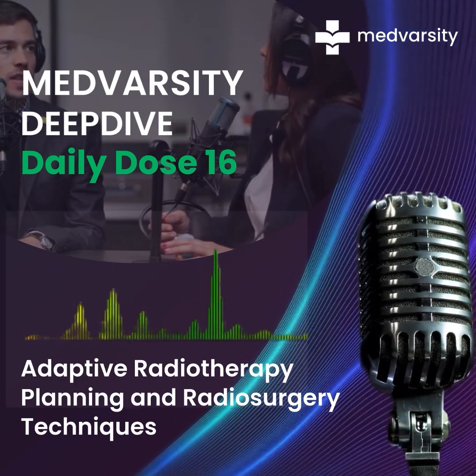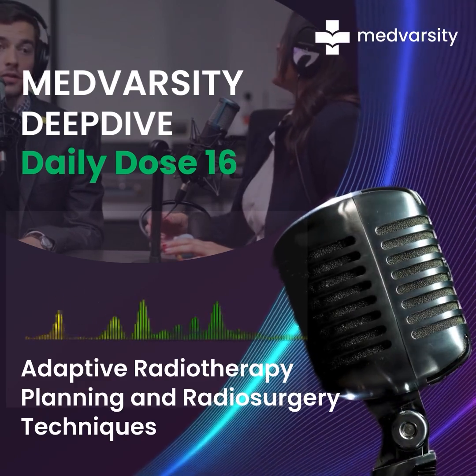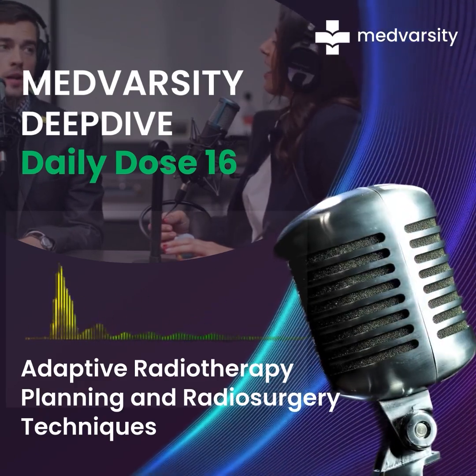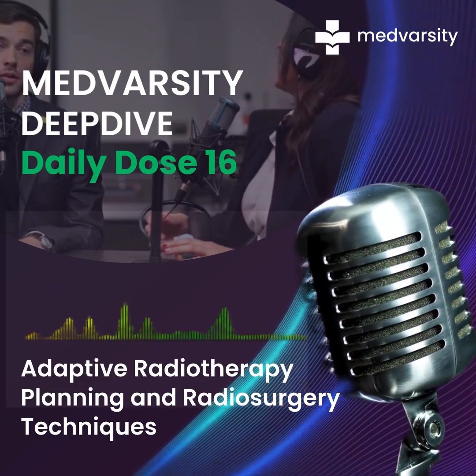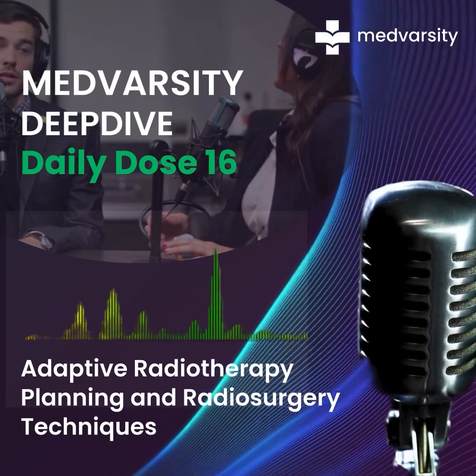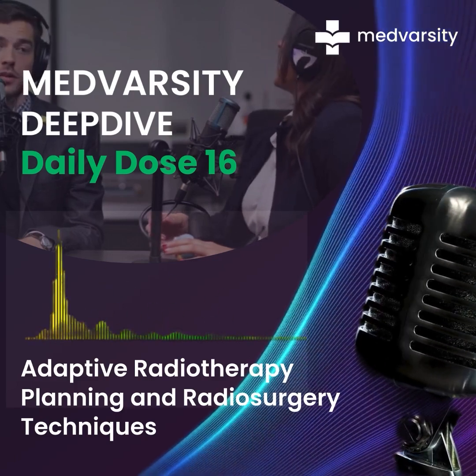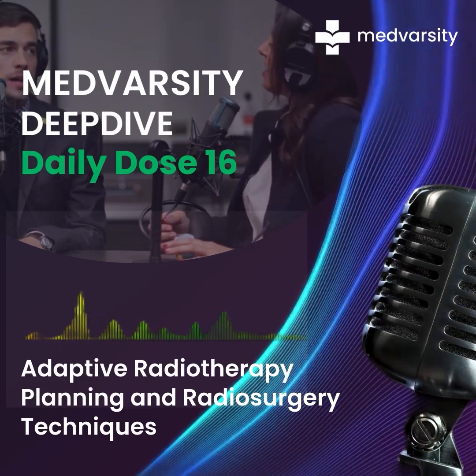That's where stereotactic radiotherapy comes in. Oh, wow. Hold on. So we're talking like a much shorter treatment time. Yes. But wouldn't that increase the risk of side effects? So it's a very powerful technique, but it's not appropriate for all tumors. It's best used for smaller tumors that have really well-defined shapes and locations.